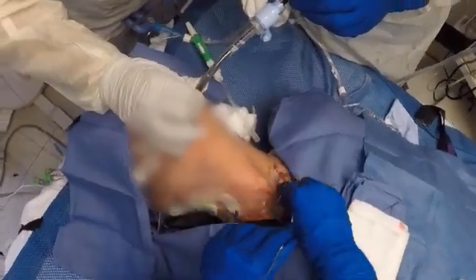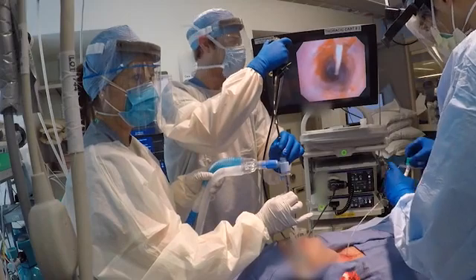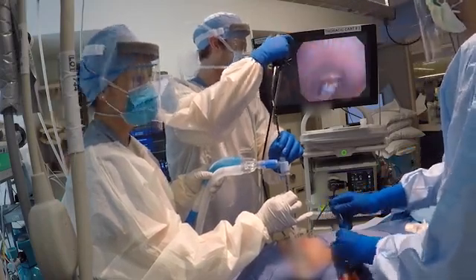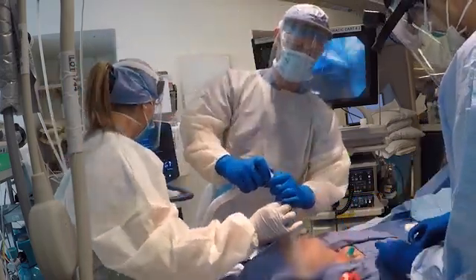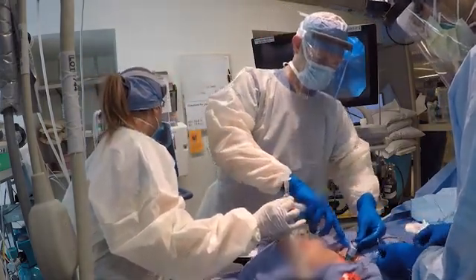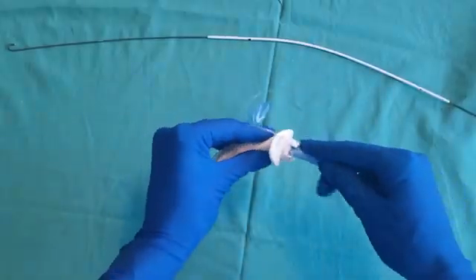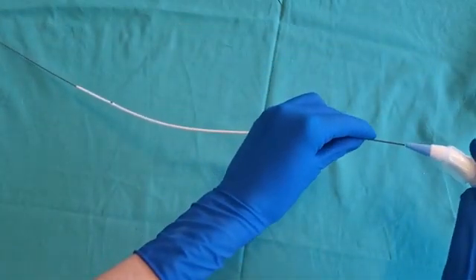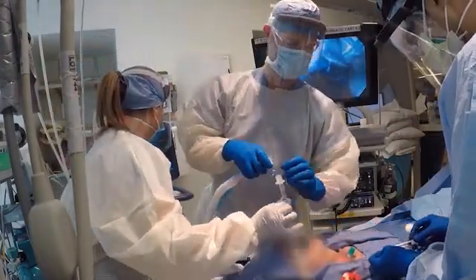Then, insert an appropriately sized tracheostomy tube directly into the trachea over the wire and protective sheath. If using a flexible tracheostomy tube, insert the tube with the curve directed toward the patient's head. Once you visualize the tube in the patient's trachea, rotate the tube 180 degrees to its normal orientation. This prevents the tube from creating a pretracheal plane. Alternatively, a non-flexible tracheostomy tube can be loaded onto an insertion trocar and advanced over the wire and protective sheath into the trachea. Remove the protective sheath, wire, and trocar if used.